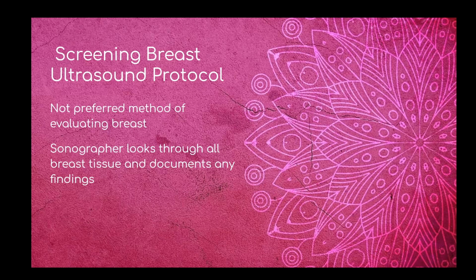If a finding is seen on that mammogram, now they have to call the patient back, and then they have to rate that lesion, and then the patient has to get a letter with the rating of that lesion. There are lots of regulations that go behind it. So when we are ultrasounding the breast, anytime we see something within the breast tissue, we have to document it, because now it has to make it into that documentation letter and be correlated with mammogram.